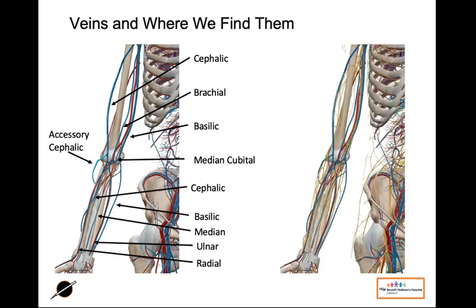We also need to be thinking about the nerves, especially with the ultrasound IV. We now have the opportunity to look under the skin. We can see the tissue there. Veins are hard to see. The nerves are hard to identify. So we need to pay attention to where our nerves come to the surface and when they're running alongside our arteries and our veins.